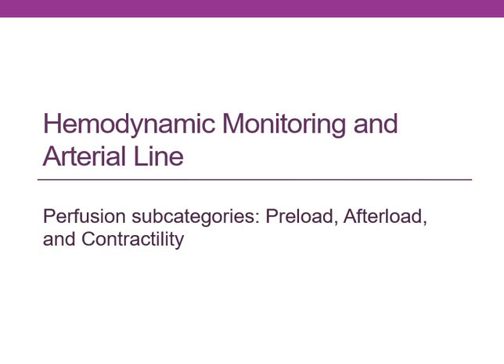And these are really used for our very sick patients, our post-op patients, like our post-op heart patients who've had bypass, and then very sick patients who are what we like to call hemodynamically unstable. That's a very broad term, and if you ask 10 nurses, you will get 10 different definitions of what that is, but it's very good so that we get real specific data.